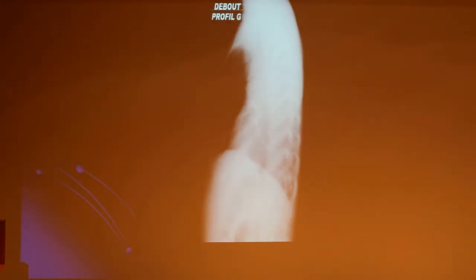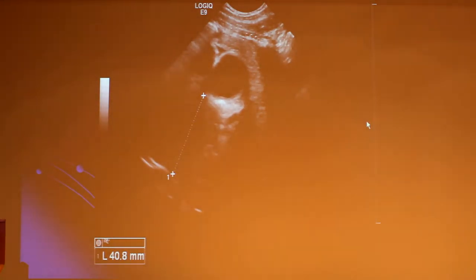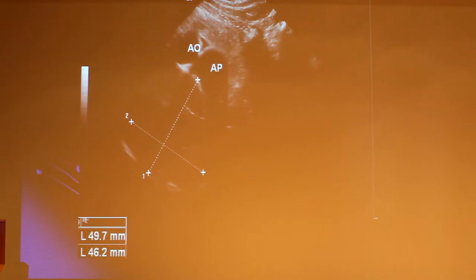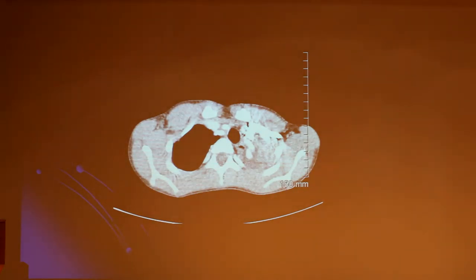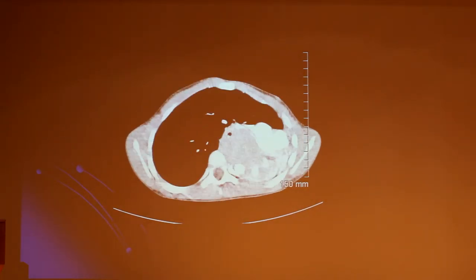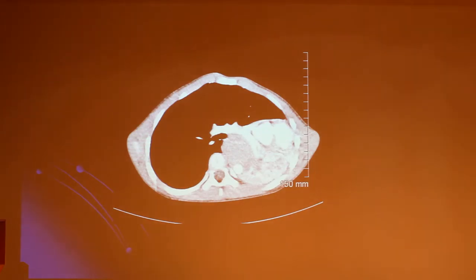We do a lateral view. The mass is not anterior. And after we do an ultrasound, and you can see the mass which is solid. We do a CT, and as you can see, there is a mass of the middle mediastinum. There is a deviation of the heart.